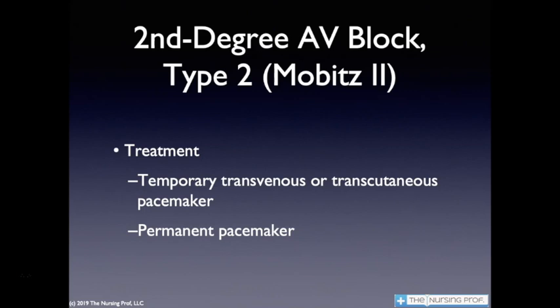So the treatment is going to be a pacemaker. We need a pacemaker so we can start pacing this guy. We don't want to wait for his heart to keep slowing down.